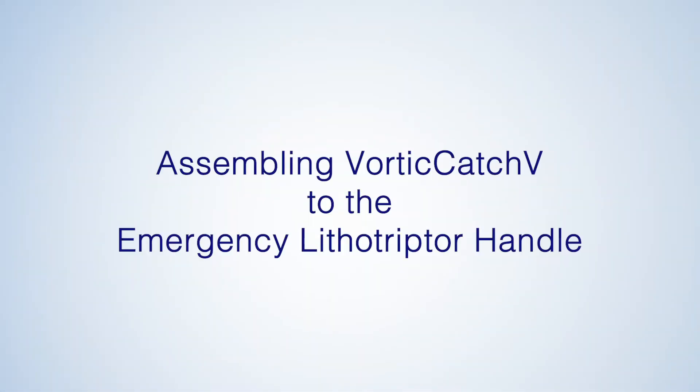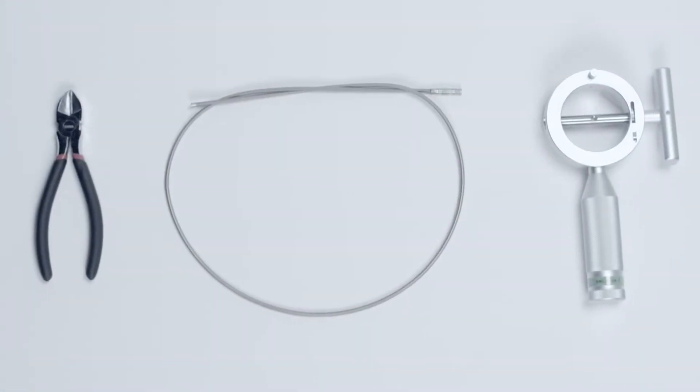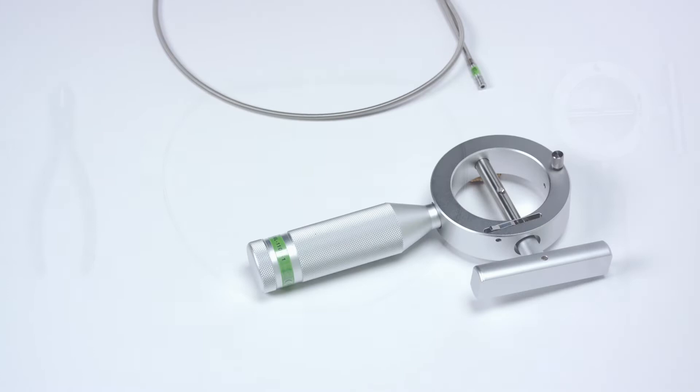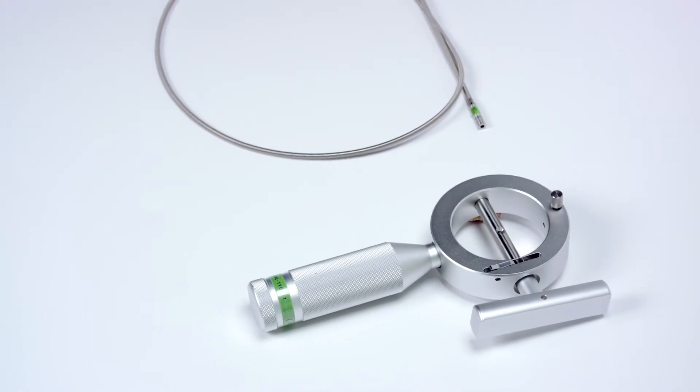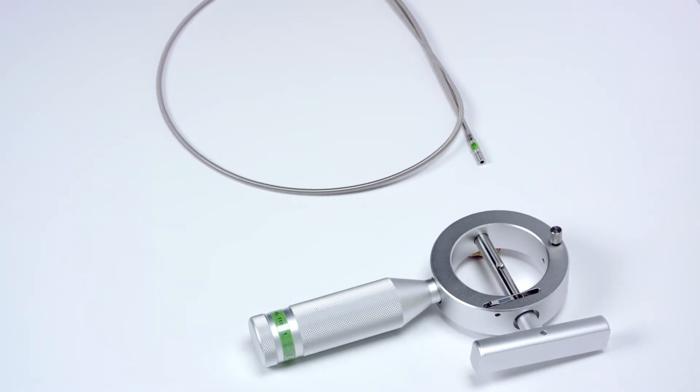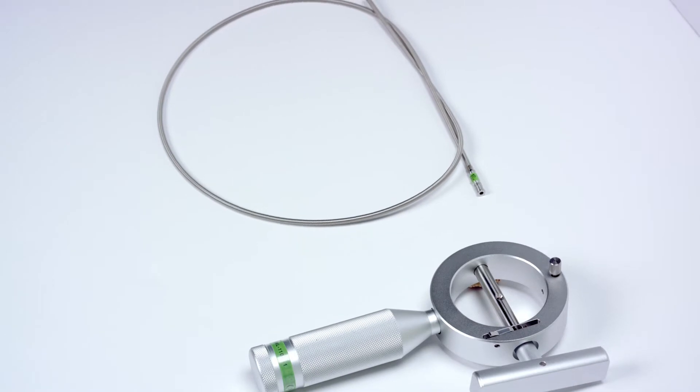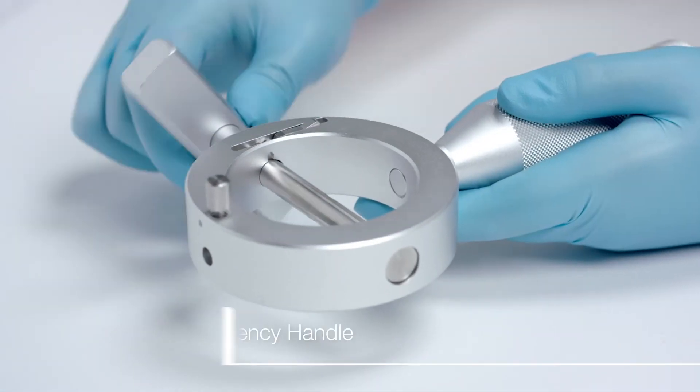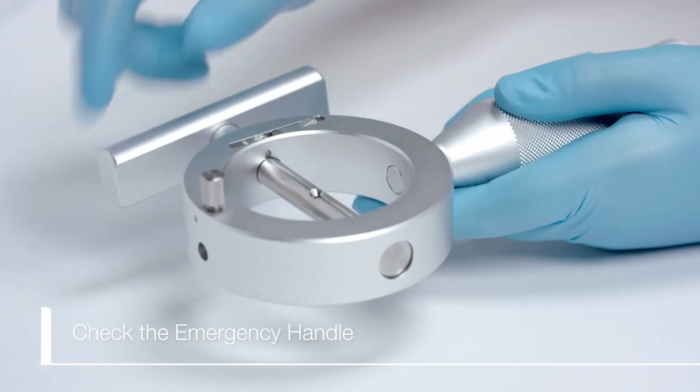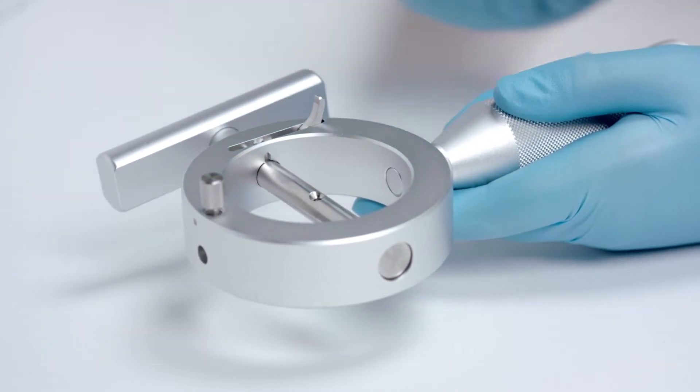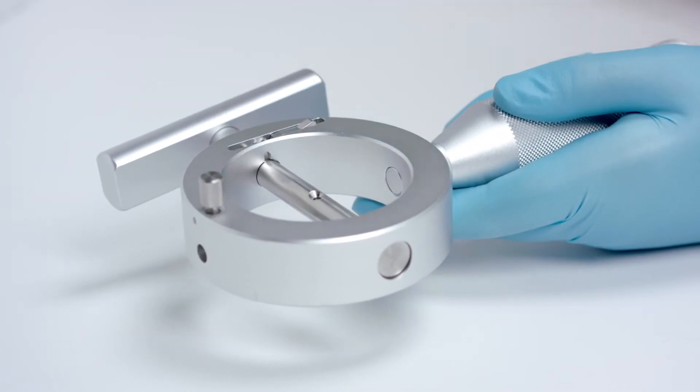In the event that the Lithocrush V Handle is unavailable, or Lithotripsy using the Lithocrush V Handle fails, then an emergency Lithotripsy handle may be used to complete emergency Lithotripsy. Before using the emergency Lithotripsy handle, ensure that the rotatable bar can freely turn and confirm the ratchet lock works by engaging and disengaging it at the handlebar.